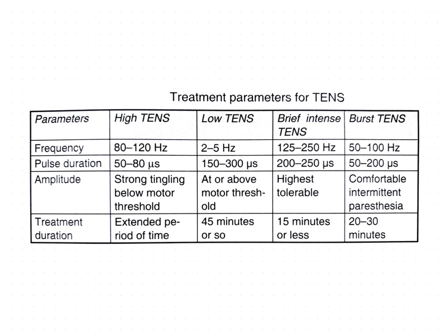If we see the disadvantages, a number of patients fail to tolerate the sensation of electrical stimulation and fail to respond to this program. Another one is skin irritation, as any allergic reaction or chemical burn may result.